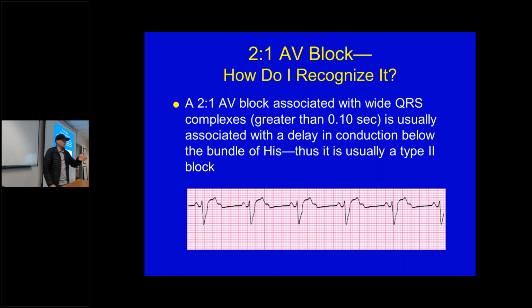but also if this is lead 2 and you have negative deflection where normally you would have positive deflection, it means that you have left axis deviation, likely a left anterior fascicular block as well, meaning going towards a left bundle branch block. Or maybe that patient has a full left bundle branch block and now has an AV block on top of it.